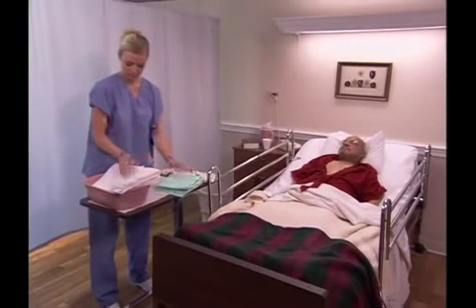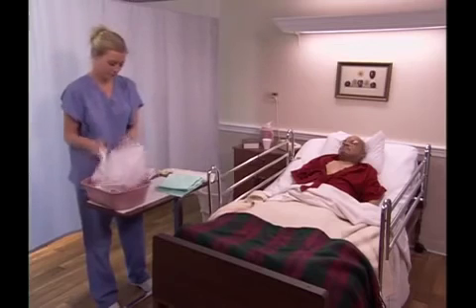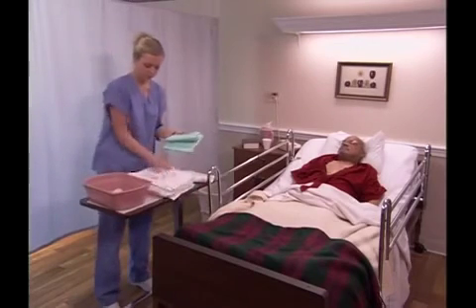Cover the overbed table with paper towels, then put the supplies on the paper towels. The supplies you will need will vary somewhat according to the position of the stoma on the person's abdomen and the manufacturer of the ostomy pouch. Make sure you follow the directions for the particular product used by your facility on each individual patient or resident.